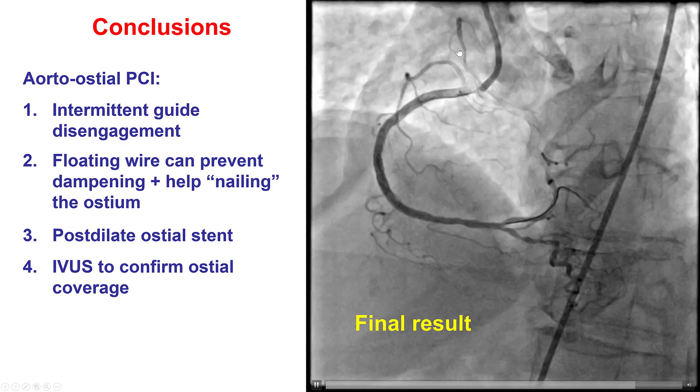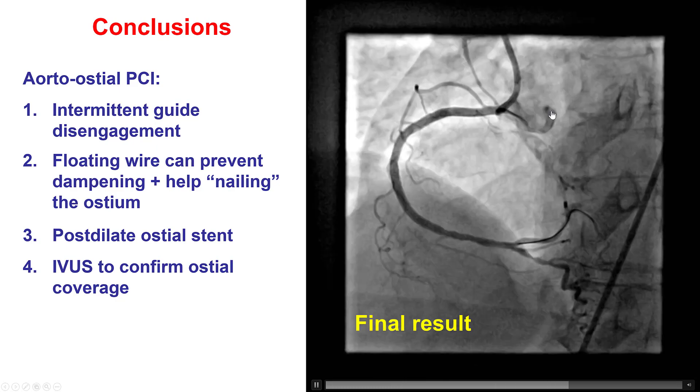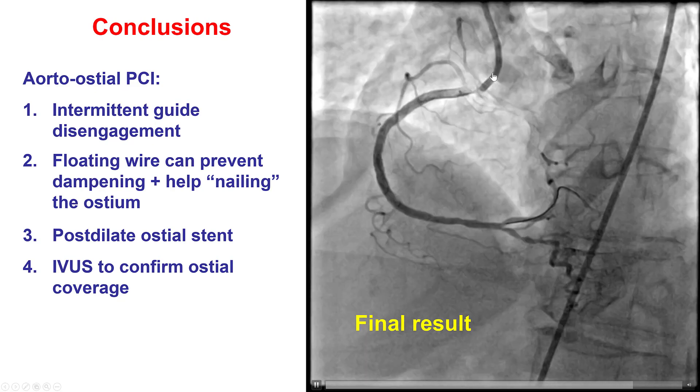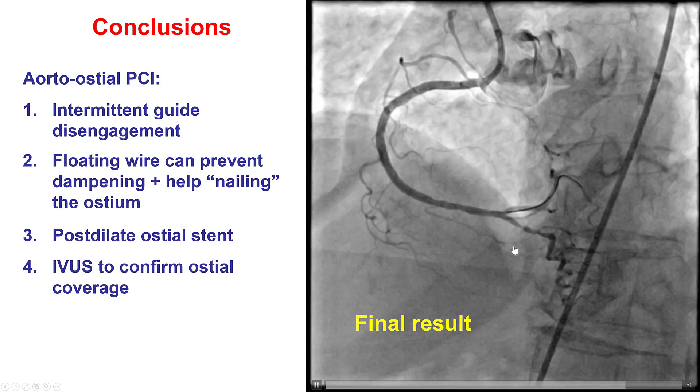This is the final result. We do have good back flow of contrast. Although IVUS is strongly recommended, if you don't use it, it is important to observe this nice back flow of contrast back into the aorta, make sure there is no pressure dampening afterwards — and that ensures a nice final result.